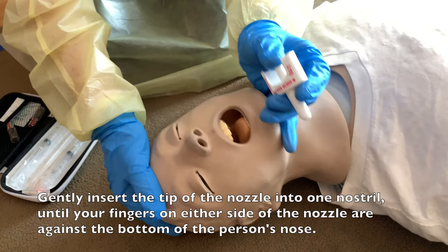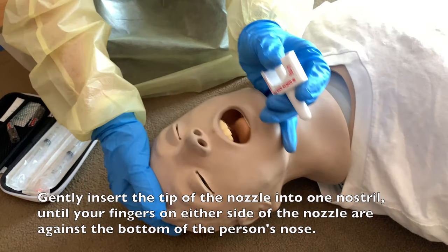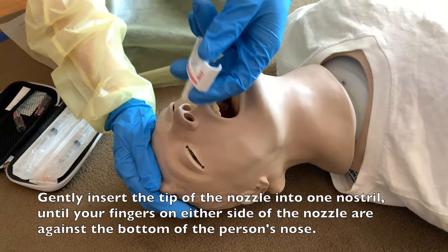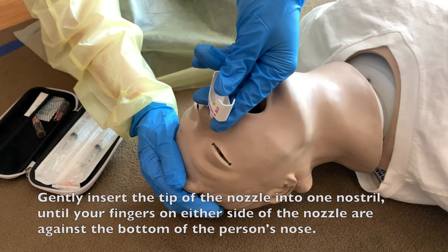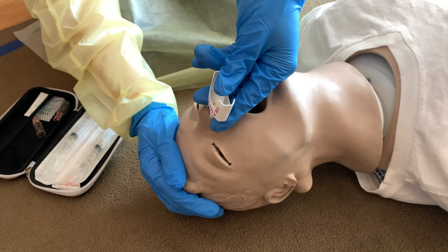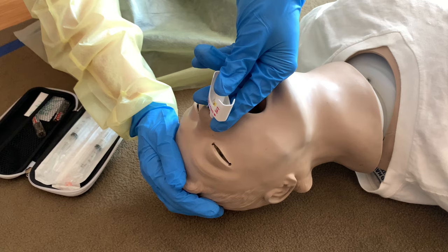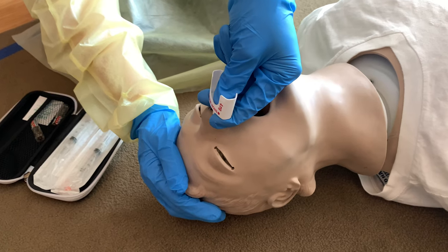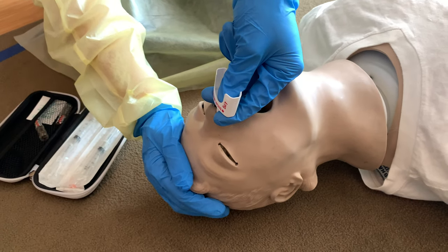Gently insert the tip of the nozzle into one nostril until your fingers on either side of the nozzle are against the bottom of the person's nose. Press the plunger firmly to give the entire dose of naloxone nasal spray.